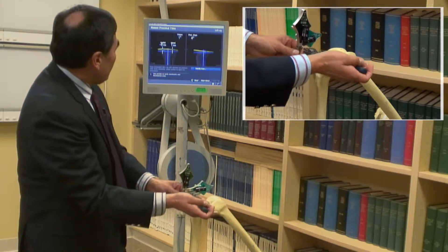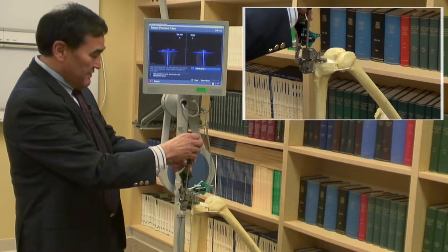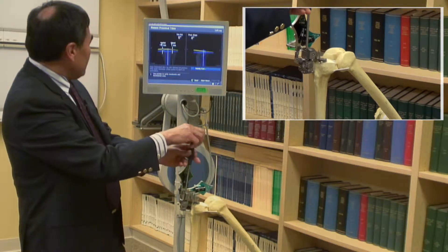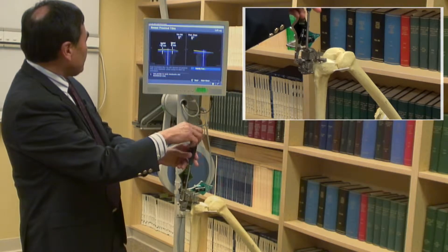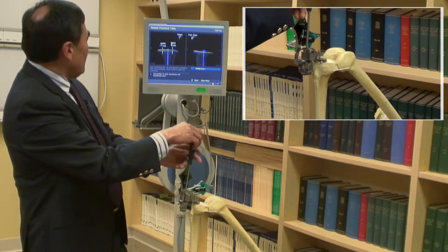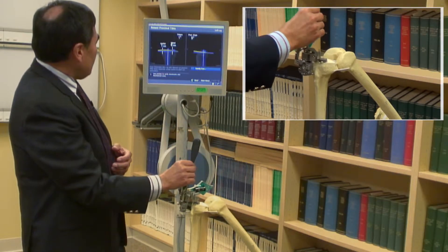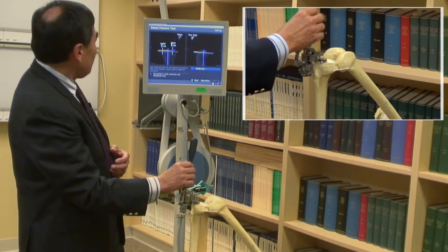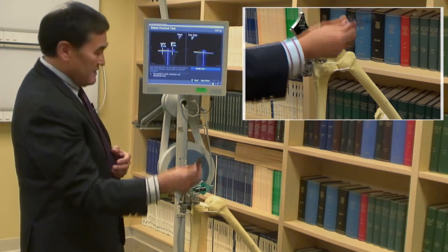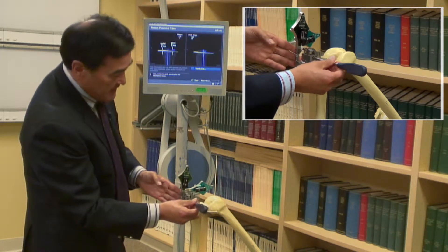Then from here, we'll adjust the amount of bony cut — typically 3 to 4 millimeters off the top of the tibia — with this device to bring it down to 4 millimeters on the medial side. Once we have the bony cuts adjusted in this position, we'll double check and make fine adjustments on all three planes for the bony cuts.